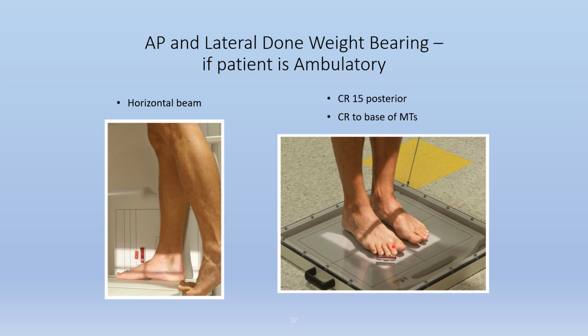When we do the lateral image, it is a horizontal beam. You would be at a 40-inch SID, likely on 10 by 12. The patient would stand erect with their full weight on that foot, and the central ray is horizontal to the level of the base of the third metatarsal. Ideally, it would be on medial cuneiform, just like a lateral foot would be. Okay, so medial cuneiform, horizontal beam, weight bearing.